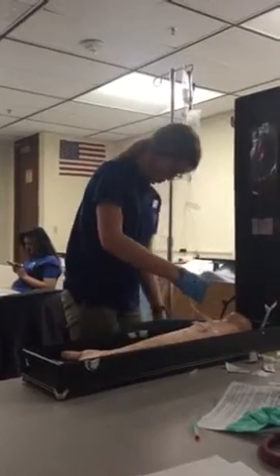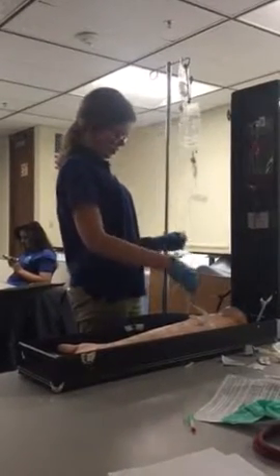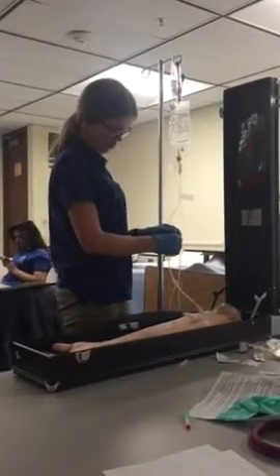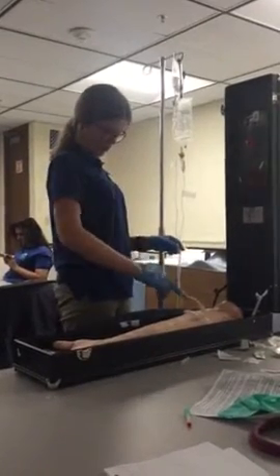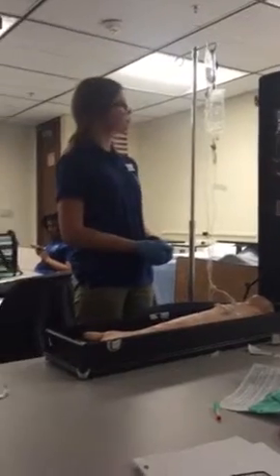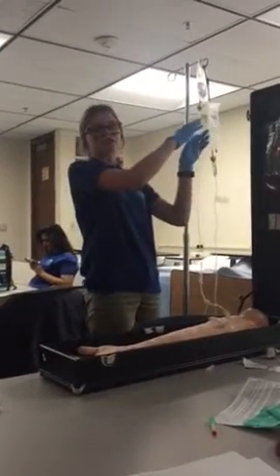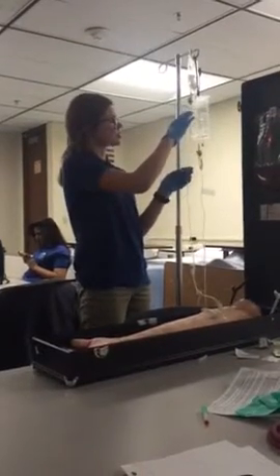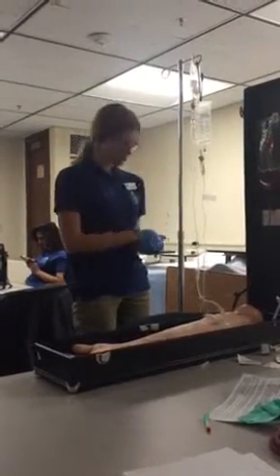And you want to clamp your primary line. I am going to sterilize the site, release the clamp on your piggyback so that it starts moving forward. Okay. So then you're establishing the new flow rate. You're watching the drops. You're making sure it's going through at the right time.